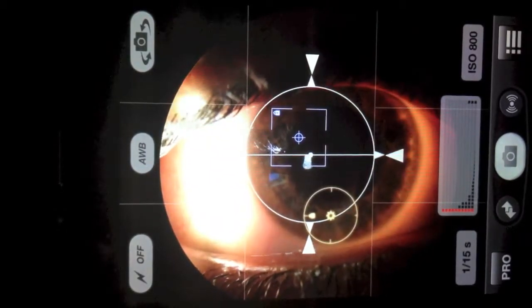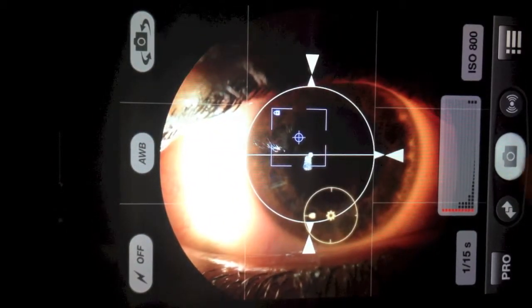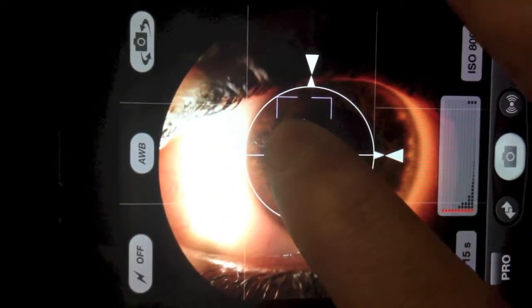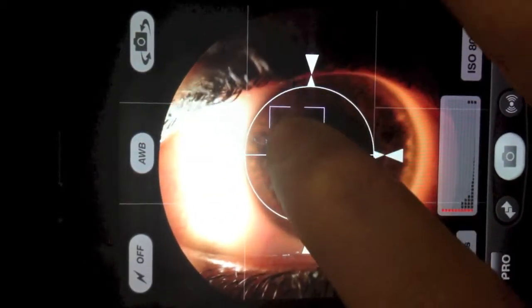Third, focus on your area of interest by holding your finger over the blue focus square over your area of interest.